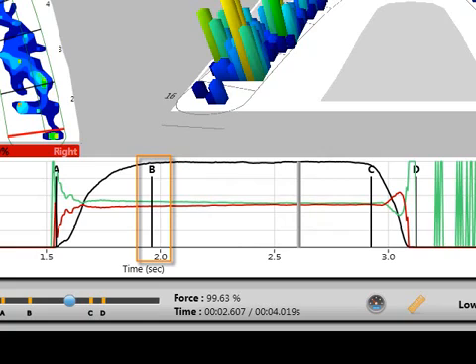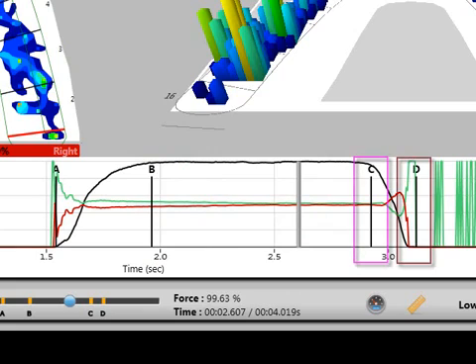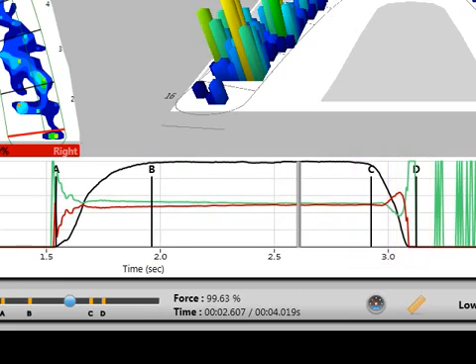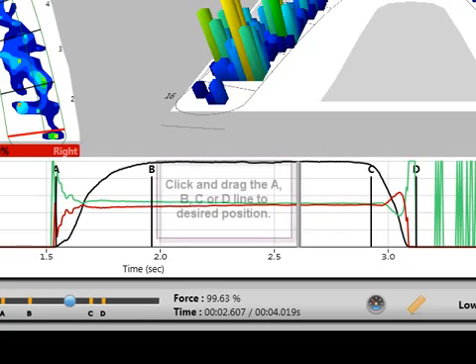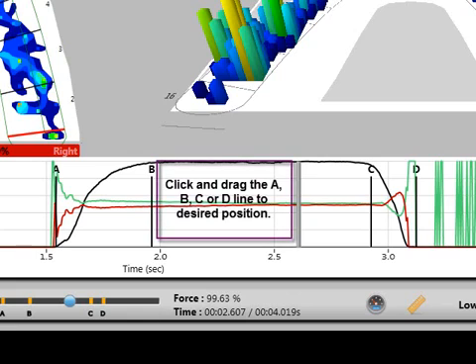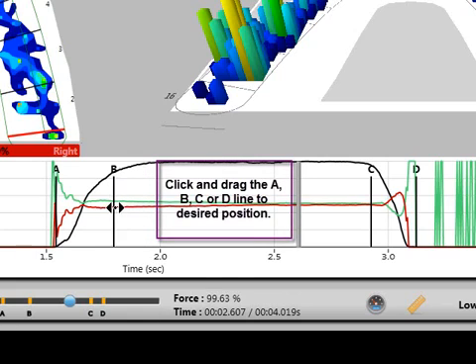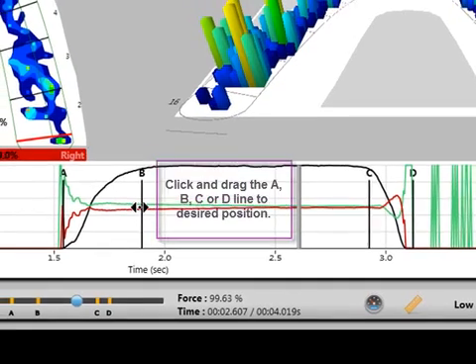The C and D lines mark the beginning and completion of an excursion. The majority of the time, the default will be correct. However, this may not always be the case based on the patient. In this case, you may wish to move the lines manually. To do this, click and drag the line to a new position.